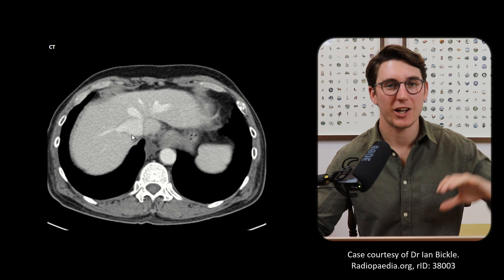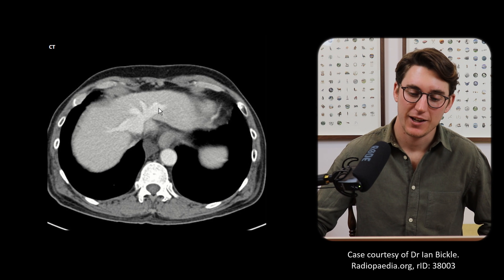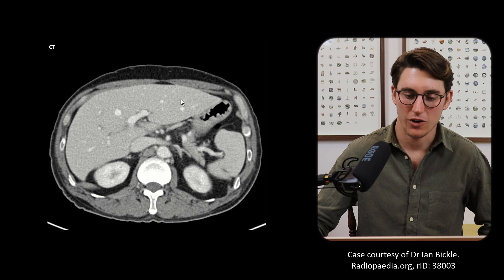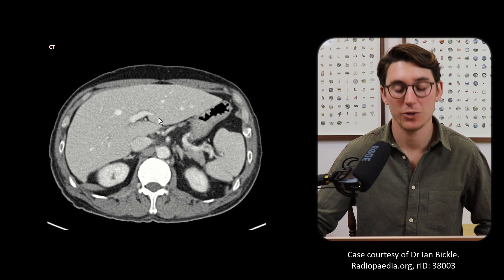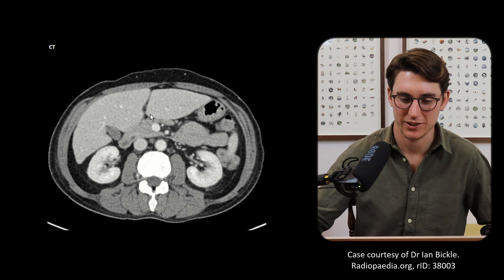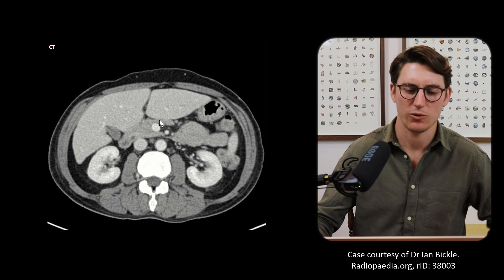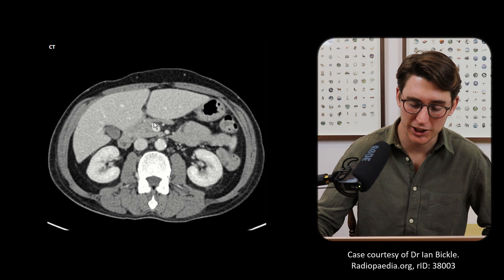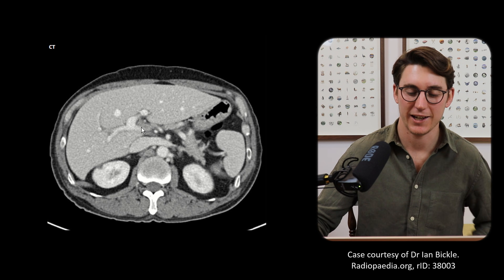Let's find segment two. We know it's superior and in the left lateral section. Lateral to our left hepatic vein is segment two — we follow all of this as segment two all the way down until we get to the level of the left hepatic vein. Above that level is all segment two. As we get to the level of our left hepatic vein, inferior to segment two, working down in the clockwise position, is segment three. The falciform ligament can be seen coming through here — some people use it as a marker between segments three and four, but technically we should use the hepatic vein. Surgically the falciform ligament is often used as the resection point, but technically we need the left hepatic vein to delineate segment three from segment four.